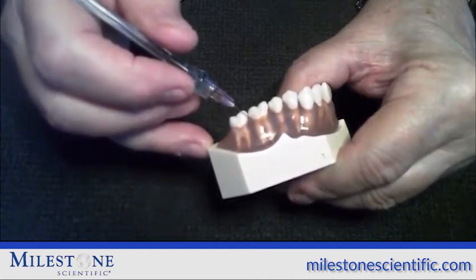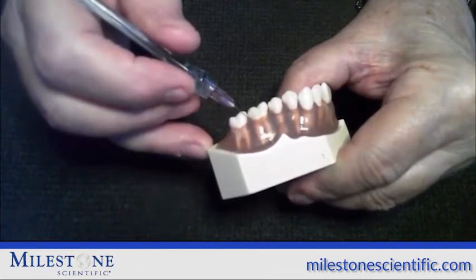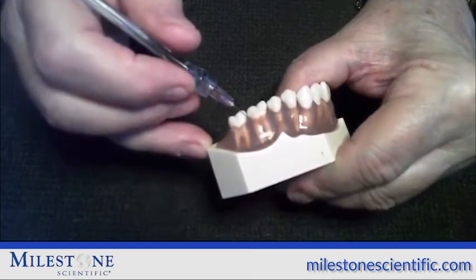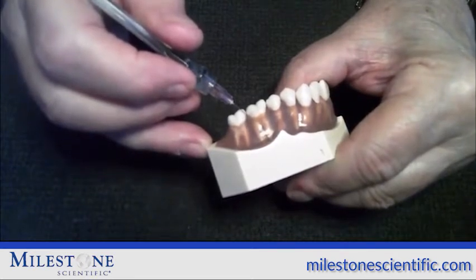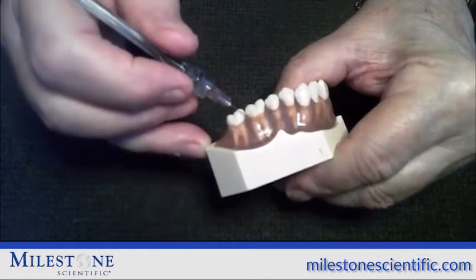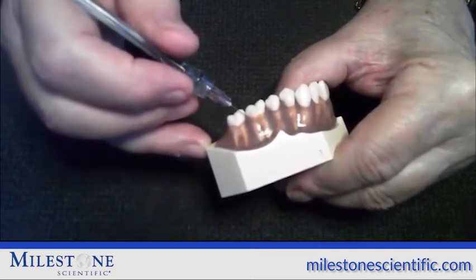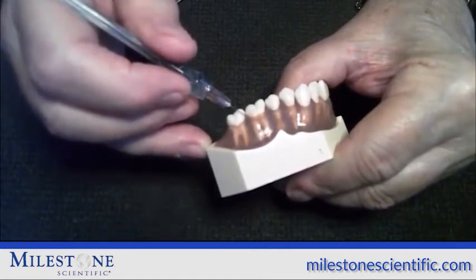Aspiration starts and it's 6 beeps. In the middle of aspiration, you take the needle out of the tissue and see how much anesthetic comes out of the needle. The DPS lights and sounds are telling you that you're in the proper spot, but they will not tell you how much pressure you put on the needle to maybe block the flow of the anesthetic from going into the bone. We can determine that by watching how much anesthetic comes out of the needle at the end of the aspiration.